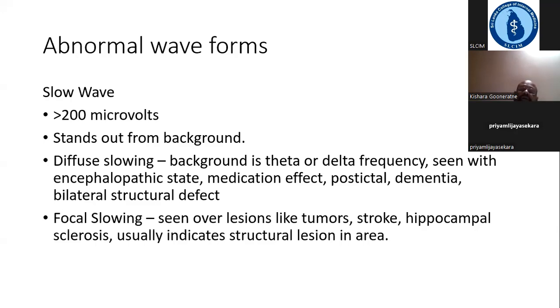Focal slowing is also seen in focal epilepsies, and might give us a clue as to where the epilepsy is coming from.